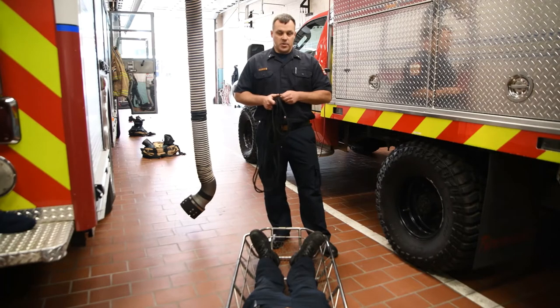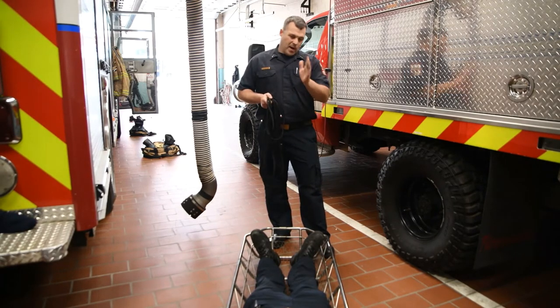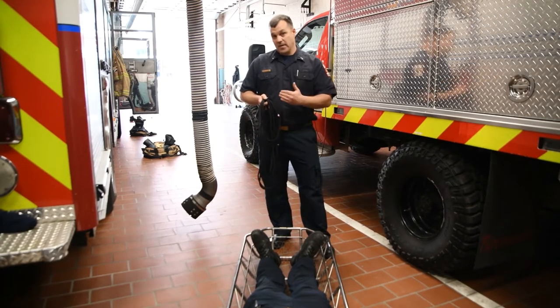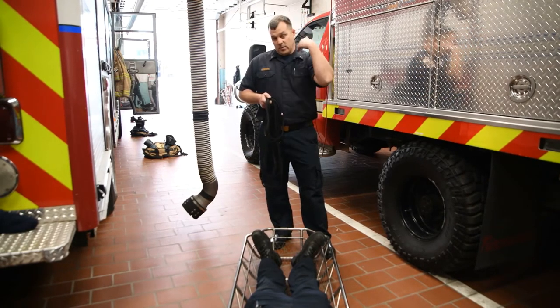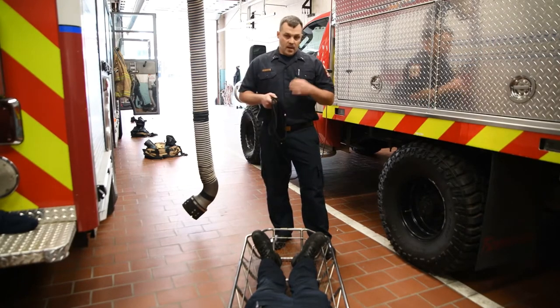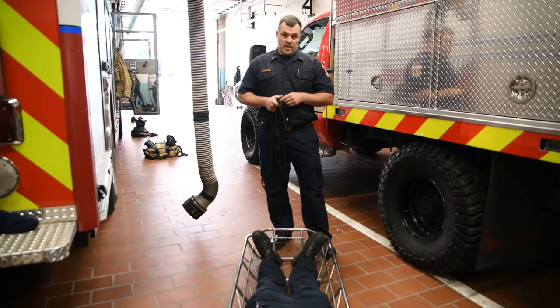Basically we are going to get rid of the heel hitch. The heel hitch was taught to possibly stop some movement in the basket; however, it is only going to stop movement one way, and that is feet first. If the patient were to get his feet elevated, it would not stop the patient's head. So if you are in a steep environment or a vertical environment, the addition of the chest harness and the seat harness is going to be necessary.